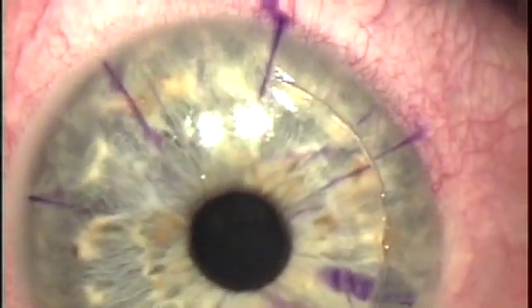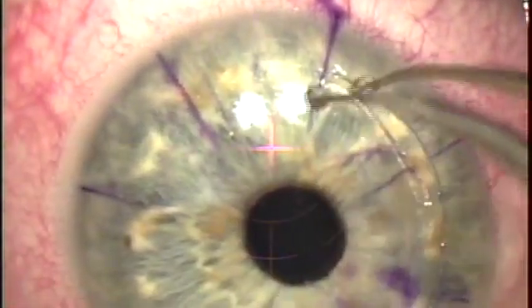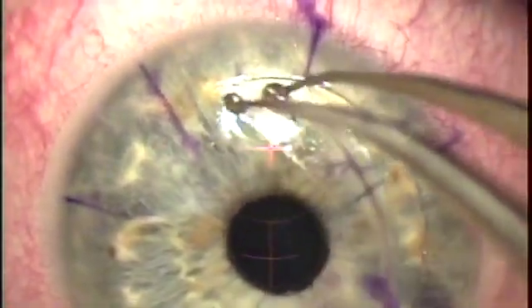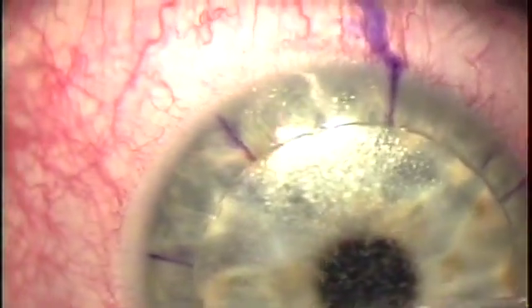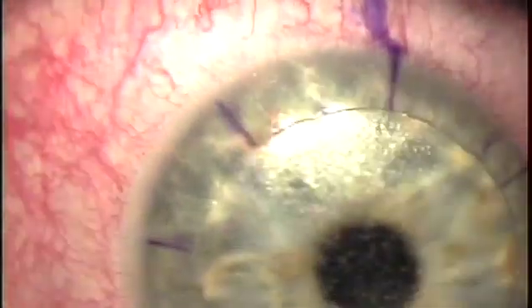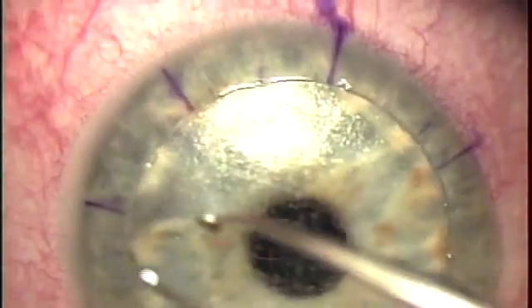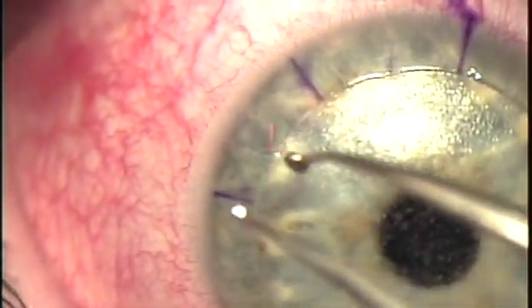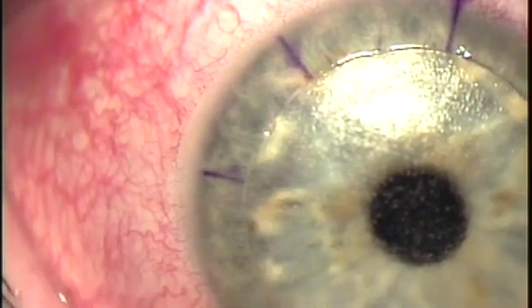This video will present the NIFT technique for LASIK enhancement. NIFT stands for Non-Ingrowth Flap Technique. One of the challenges in LASIK enhancements is that the rate of epithelial ingrowth under the flap edge during the healing process can approach 5, 10, or even 15% incidence.